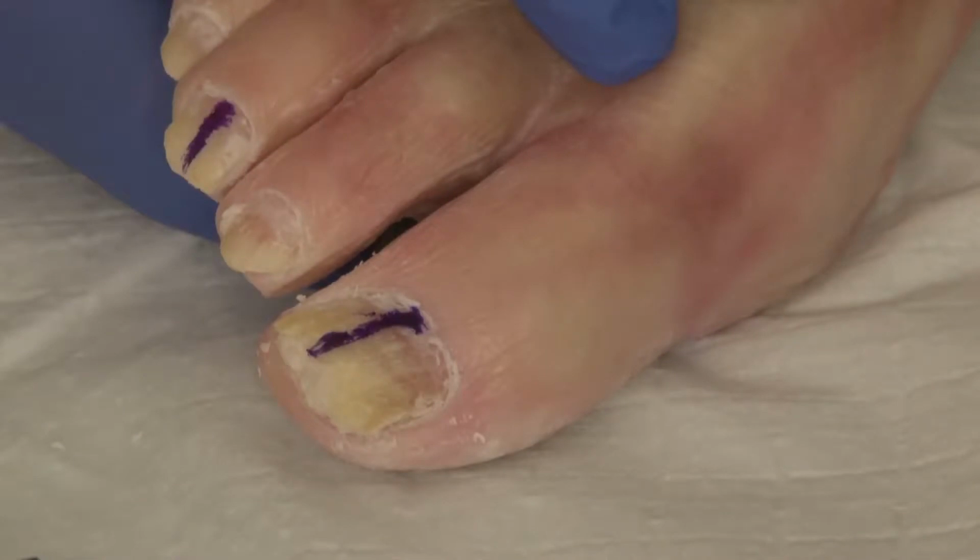I am now going to demonstrate the tangential nail matrix shave biopsy. This procedure is done routinely for longitudinal melanonychia, and it is thought that this type of procedure is best to preserve the cosmetic appearance of the toenail after healing of the biopsy site. The reason that this is of importance is because the vast majority of longitudinal melanonychia lesions are benign in nature, and we would like to preserve the cosmesis of the nail plate as best as possible.